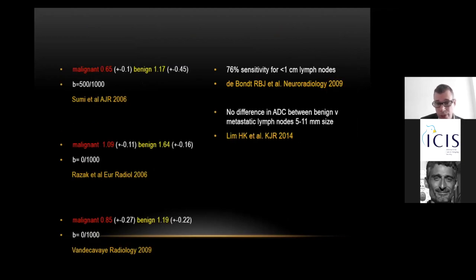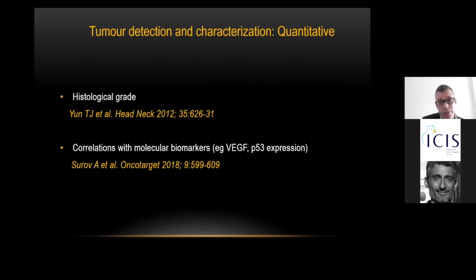First of all, if you look at the studies, the thresholds differ quite markedly, and it's certainly not been a universal finding. Moreover, we already have really quite robust diagnostic pathways in terms of distinguishing malignant lymph nodes, and it's often a difficult process to perform in view of the heterogeneity of lymph nodes. And it's understandable that there may well be quite marked variations even in benign lymph nodes, because areas of lymphoid follicles and stromal fibrosis in reactive lymph nodes can actually result in restricted diffusion.